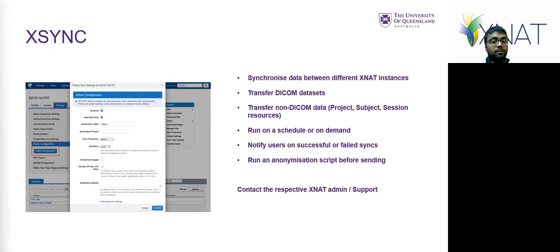Where we've used it already is the big multi-site trials, where maybe Monash is collecting all the data from various sites, so we can just sync it over, so it's all automatic and then just pops up in the XNAT and the classroom. So we've done it for multi-site trials, and we've done it to, I think, Perth, and to a couple to Sydney, I think, as well.